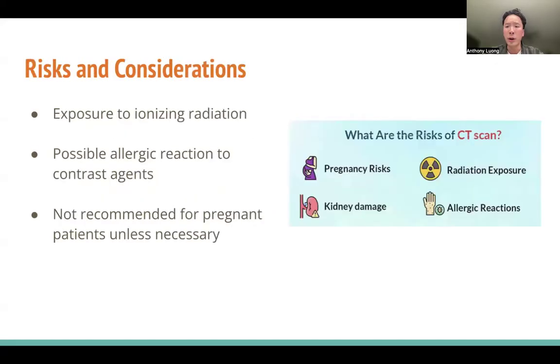Risks and some considerations of using CT scans that you should all be aware of are exposure to radiation, obviously, possible reactions to contrast, and lastly, it's not recommended to use CT for pregnant patients unless necessary.